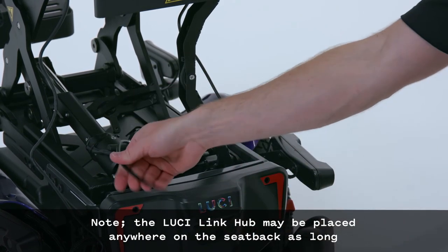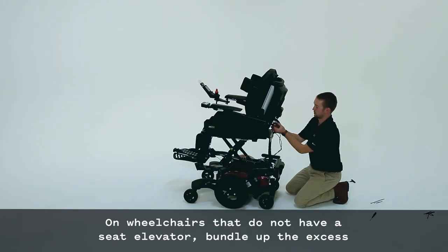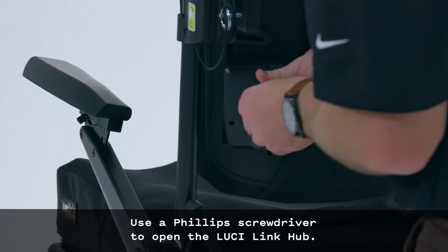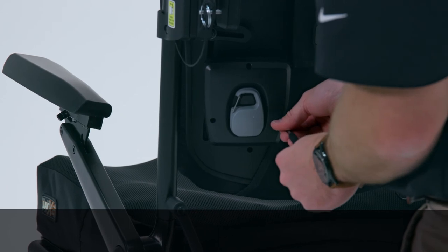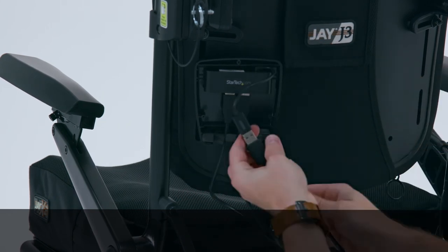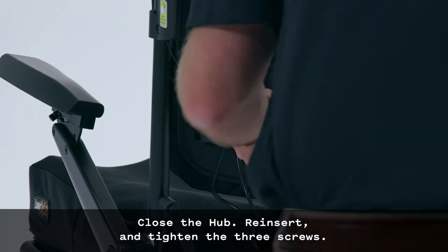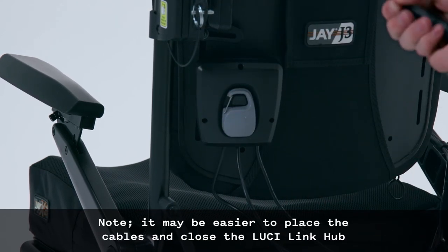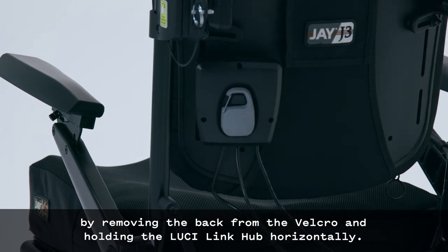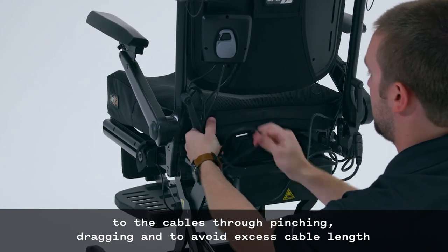Note: the LucyLink hub may be placed anywhere on the seat back as long as it does not limit the range of motion of the seat, armrests, etc. On wheelchairs without a seat elevator, bundle up the excess USB cable and zip tie it to the back of the chair. Use a Phillips screwdriver to open the LucyLink hub. Plug the scout and dashboard USB cables into the LucyLink hub and connect the smart frame USB cable to the LucyLink hub. Place the cables so that the LucyLink hub can be closed, then reinsert and tighten the three screws. It may be easier to close the hub by removing the back cover from the Velcro and holding the hub horizontally. All cables should be installed, bundled, and routed to avoid damage through pinching, dragging, and excess cable length.